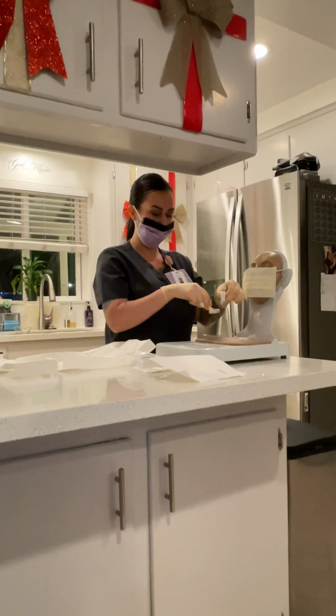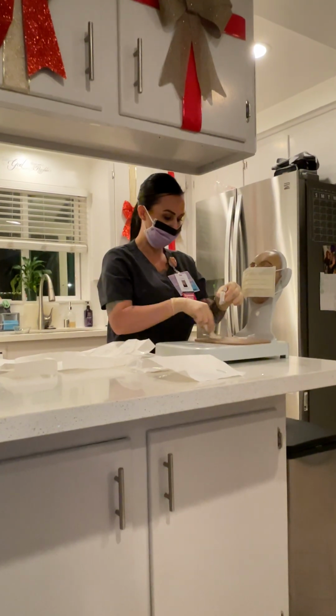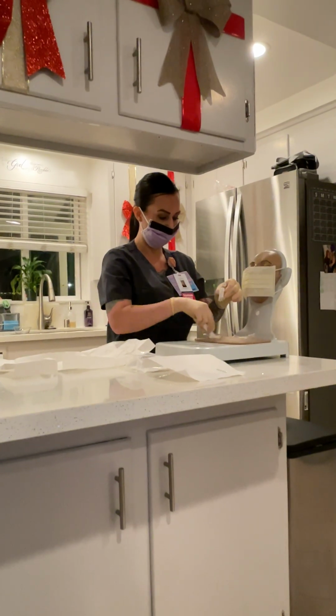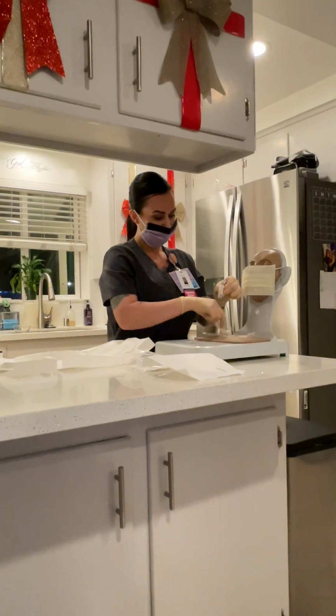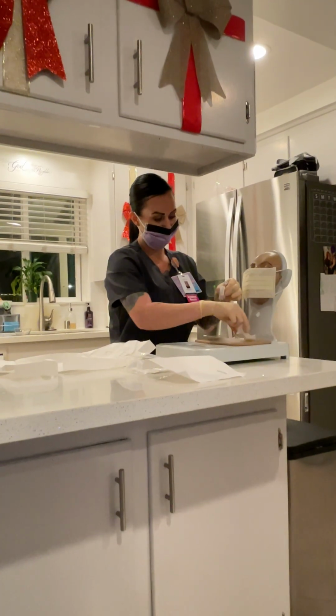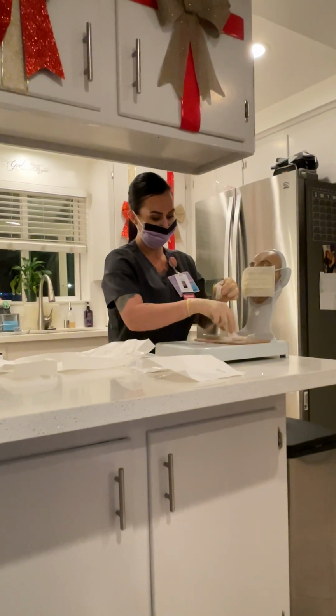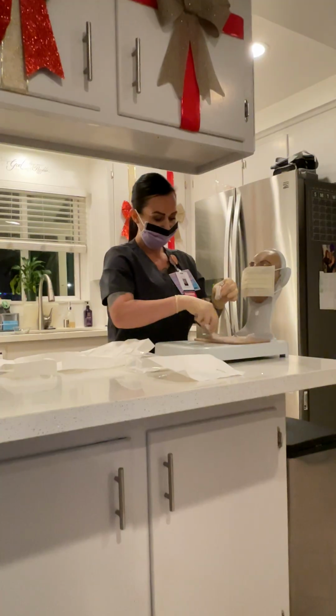In the same kind of area that we would have our tape. 1, 2, 3, 4, 5, ... 30.